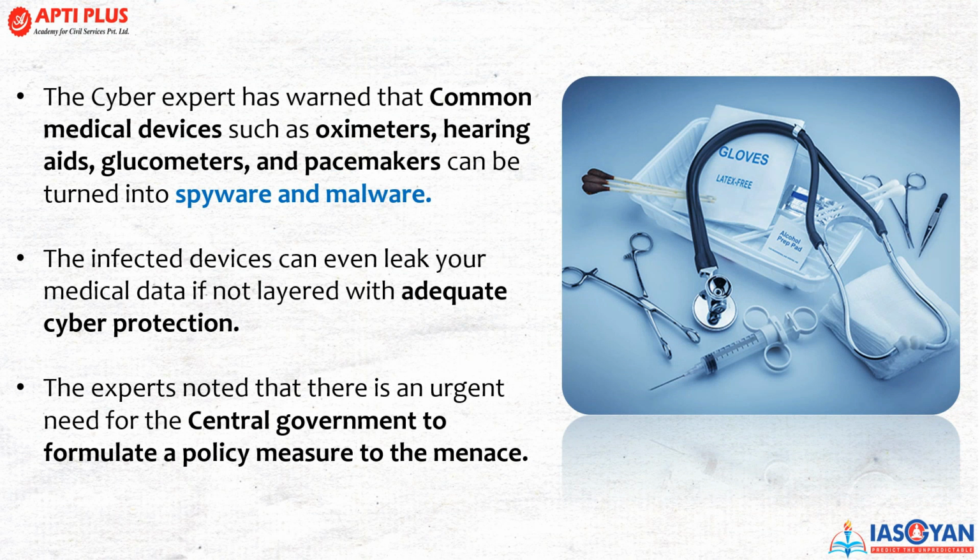And these infected devices can even leak your medical data, which is not layered with adequate cyber protection. See, the prices of these items are not that high, and invariably the need for that protection was not required. But the concern has been raised that in recent times, these medical aid devices are taking your data and somewhere it is being shared in the cloud. Now, the cyber experts have noted there's an urgent need for the central government to formulate a policy to overcome this menace, right? So this is the basic premise of the discussion.